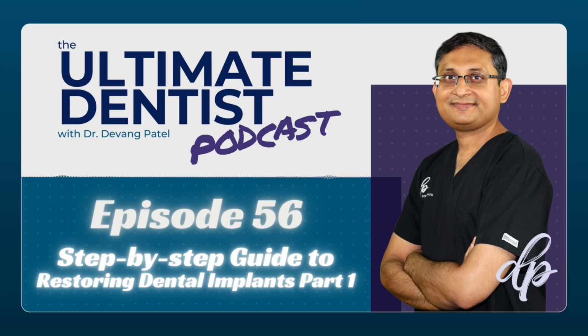How can we manage it? Generally, the defect is going to be composite, which means a hard and soft tissue defect. Generally, you don't have just one or the other. Many times you can place the implant in the bone without doing bone grafting, and just do soft tissue grafting. But if there is a defect, generally it's both. So you have a little bit of soft tissue and a little bit of hard tissue defect.